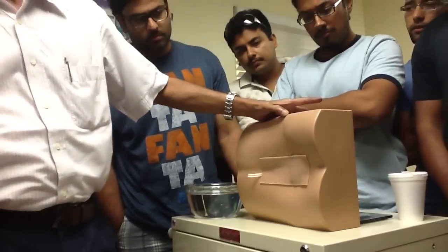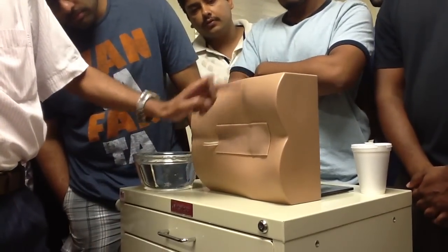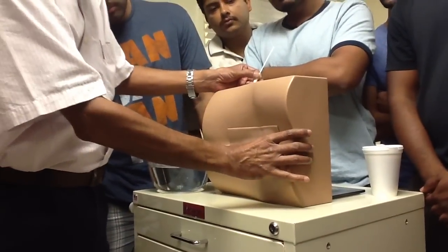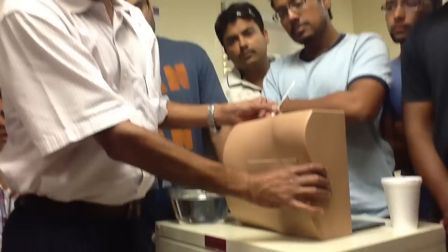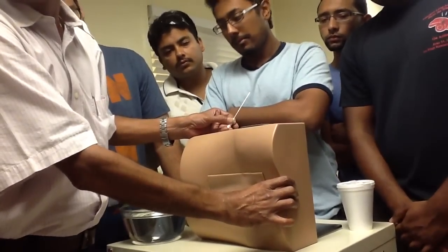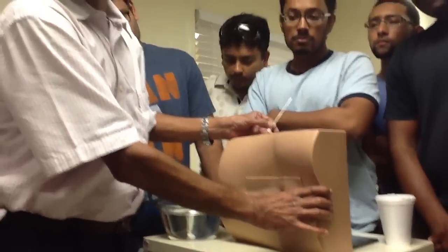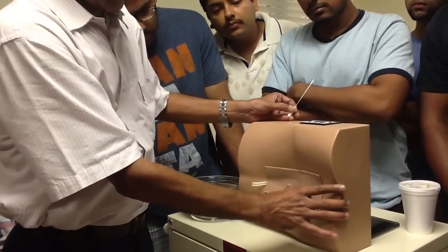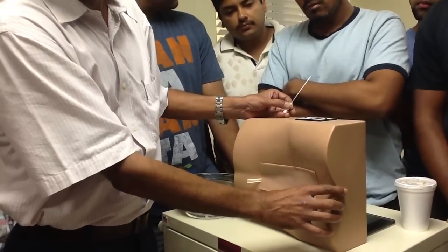This is the iliac crest — the highest point of the iliac crest. When you join the two points, this is the supracrystal plane. When you feel, you will feel that there is a spinous process here — that happens to be the L4 spinous process. Just below that, where my finger is dipping in, is the L4-L5 space. Just above that is the L3-L4 space. One space above that is L2-L3. I'll demonstrate in several spaces for you.